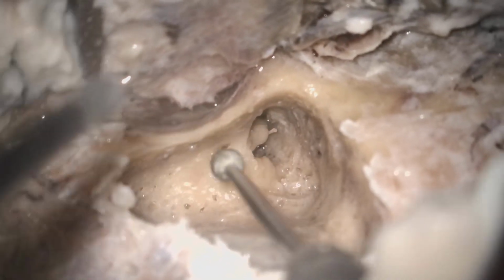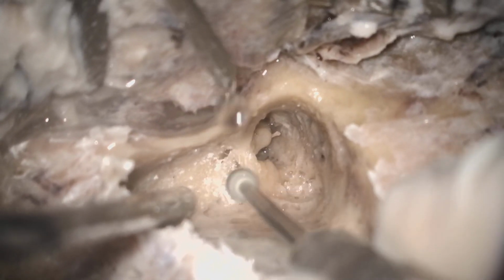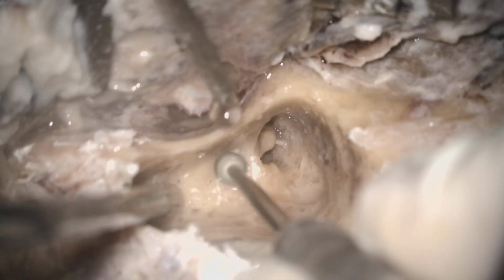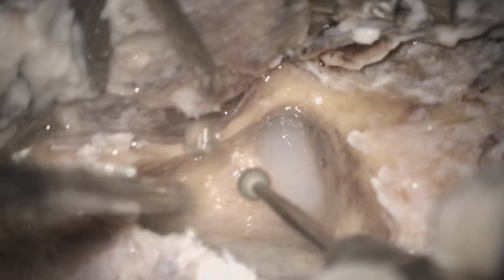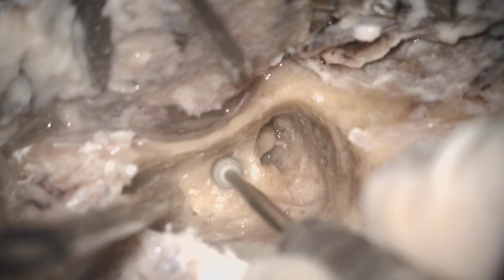Okay, and layer by layer you have to dissect, you have to identify all the landmarks. So this is the incus buttress, and we are going medial to the lateral semicircular canal. So now there will be a chance of the facial nerve appearing anytime. So always keep your eye on that area. Your focus should be on the tract of the facial nerve.